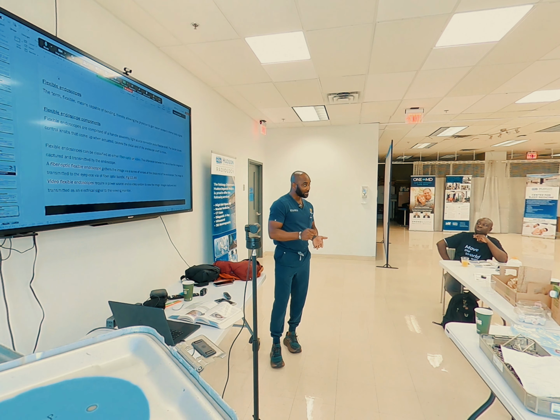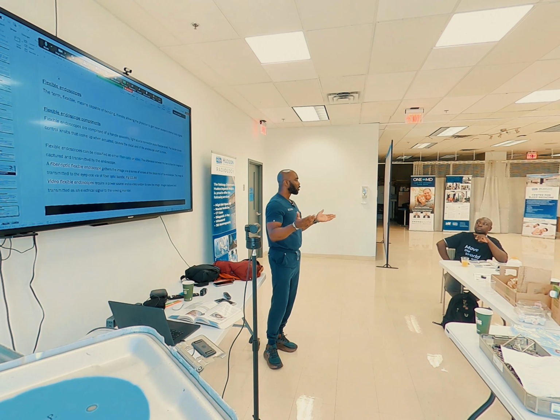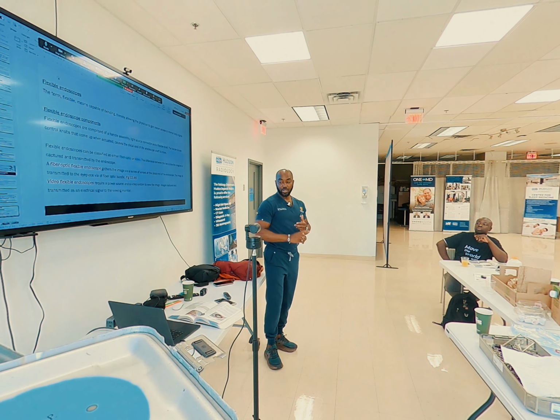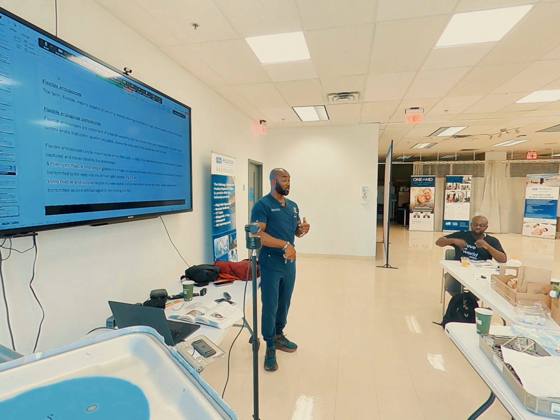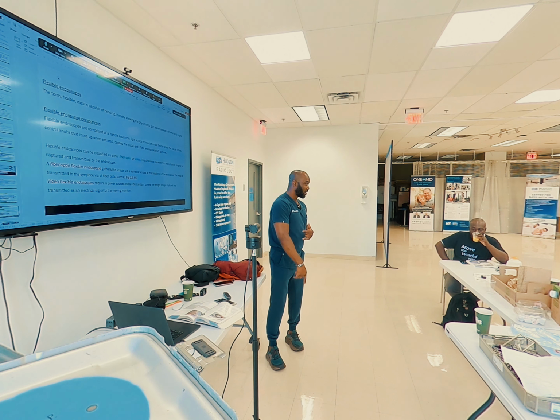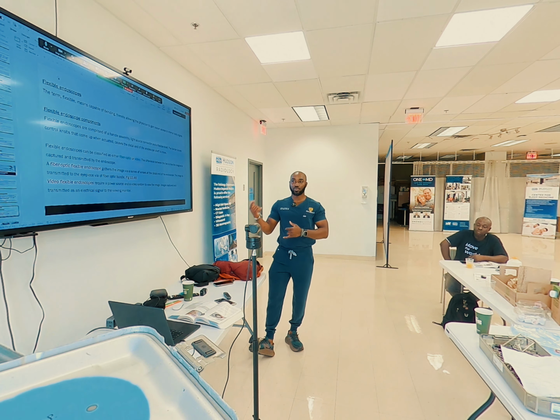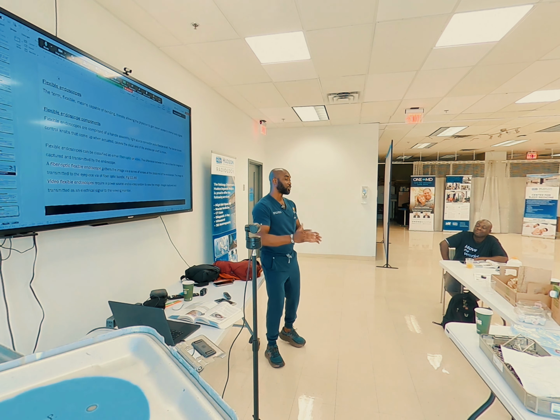It's documented, right? When you reprocess with your AER, the automated endoscopic reprocessor, you have printouts. They can go back and plug that thing into a computer. If you lie on paper saying that you did an automated reprocessing, when you do your endoscopic reprocessing on those scopes, you record the serial number of the scope, you record the doctor who used the scope, you record the name of the patient the scope was used on, you record the date, you record their number, the catalog number of the Rapicide, the high level disinfectant used. All of this information is traceable.